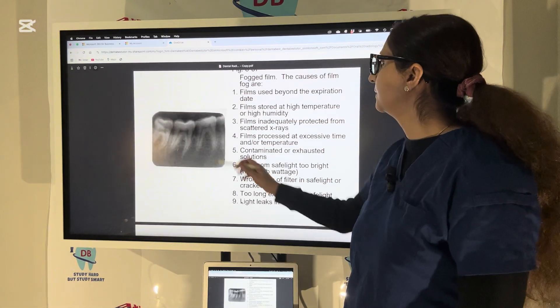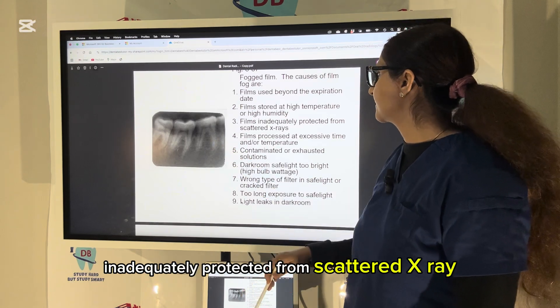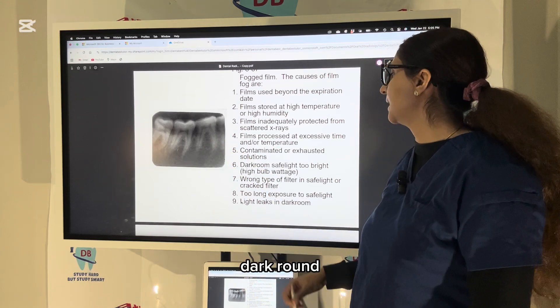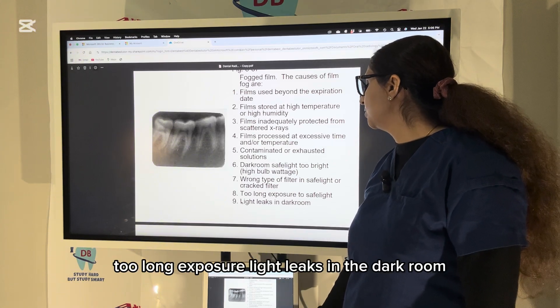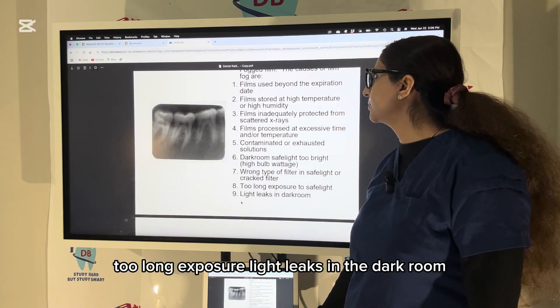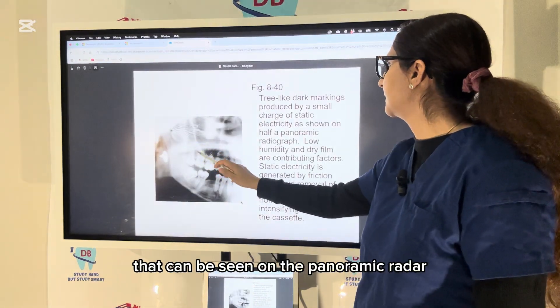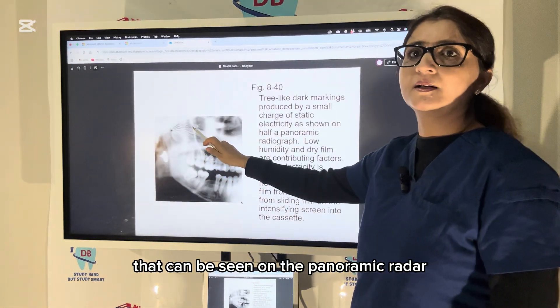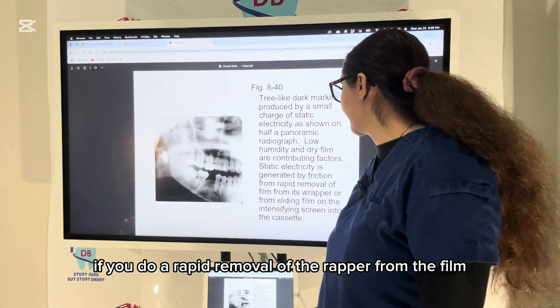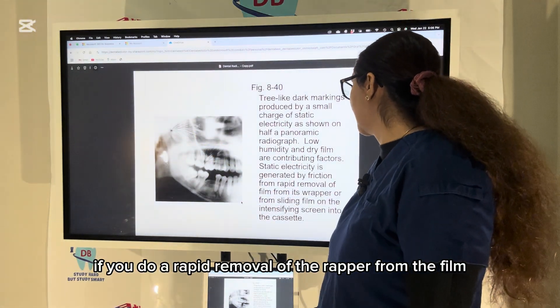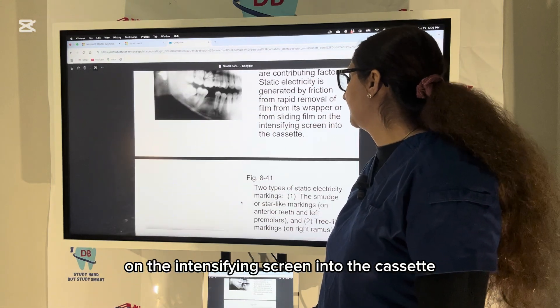Fogging of the film can result from using the film beyond its expiration date, inadequate protection from scattered X-rays, contaminated or exhausted solution, a dark room safelight that is too bright, too-long exposure to light, or light leaks in the dark room. This tree-like marking is a static electricity mark seen on the panoramic radiograph — it is generated by friction from rapid removal of the wrapper from the film on the intensifying screen into the cassette.